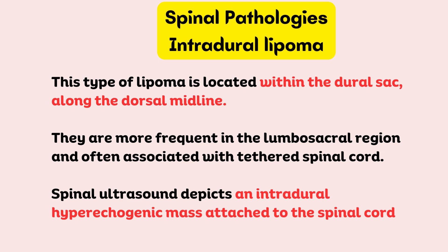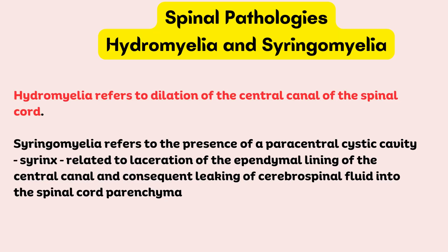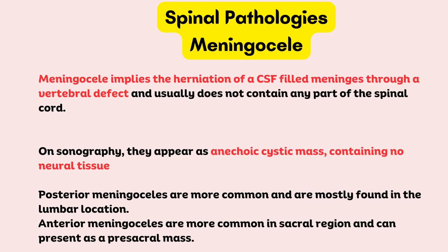Spinal ultrasound depicts an intradural hyperechogenic mass attached to the spinal cord. Diastematomyelia is characterized by the sagittal division of the spinal cord into two symmetrical or asymmetrical hemichords; the lumbar segment is frequently affected, and ultrasound imaging in the axial plane demonstrates the presence of two hemichords. Hydromyelia refers to dilation of the central canal of the spinal cord. Syringomyelia refers to the presence of a paracentral cystic cavity (syrinx) related to laceration of the ependymal lining and consequent leaking of CSF into the spinal cord parenchyma. Meningocele implies herniation of a CSF-filled meninges through a vertebral defect and usually does not contain any part of the spinal cord; on sonography they appear as anechoic cystic masses containing no neural tissue. Posterior meningoceles are more common and mostly found in the lumbar location, while anterior meningoceles are more common in the sacral region and can present as a presacral mass.